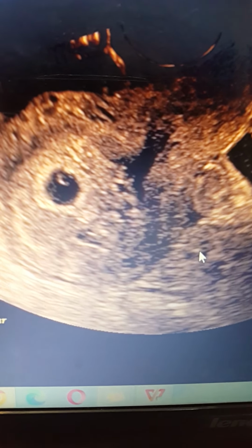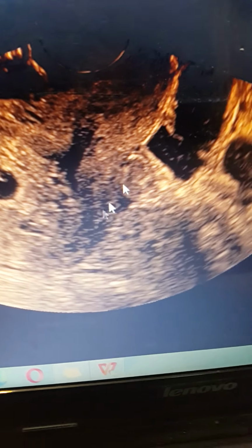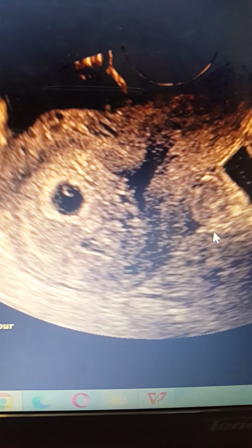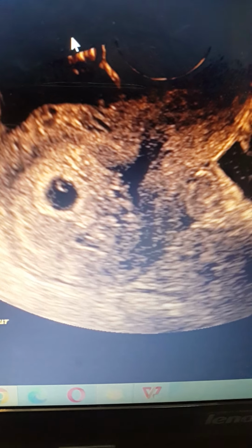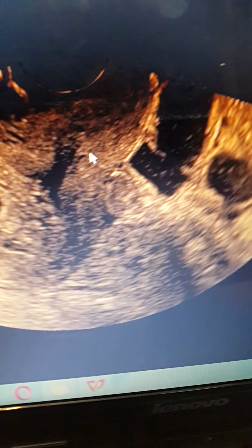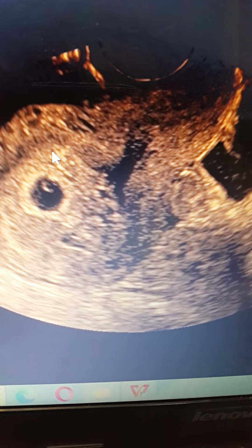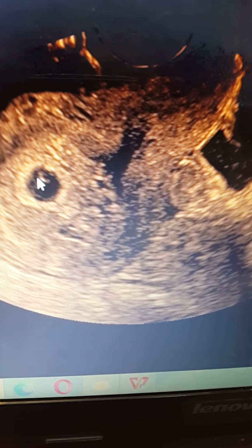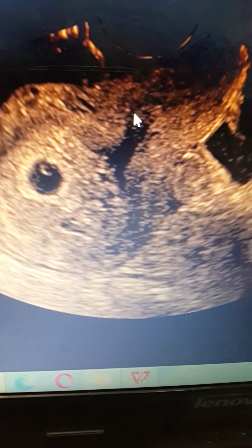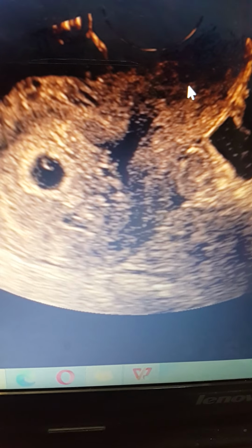But the teaching points in this case specifically are the following. Of course, this is a transvaginal ultrasound, and this is the urinary bladder. As we know from our basic ultrasound scans, the urinary bladder is at the upper left side when you are using the probe, the way we have mentioned in our basic ultrasound courses. So this is an AVF uterus, and this is the urinary bladder, and this is the gestational sac, and this is a yolk sac inside, and this is a tiny separation. As you can see, this funneling is a supracervical separation of the sac, and so she may develop some spotting, vaginal bleeding.